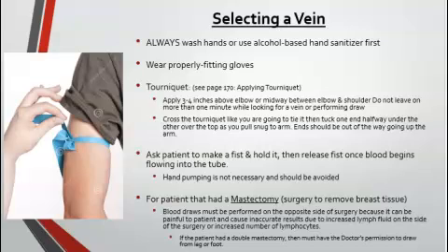It's important that you tie the tourniquet correctly, and it's important that the tourniquet is tied snugly on the arm. When you're tying the tourniquet, you want to make sure that you're tying it in a way that one end is only tucked in, and this allows for a quick release of the tourniquet. We will be practicing on each other exactly how to tie the tourniquet, so you can practice how tight and how to get the tourniquet tied exactly right in order to have a quick release.